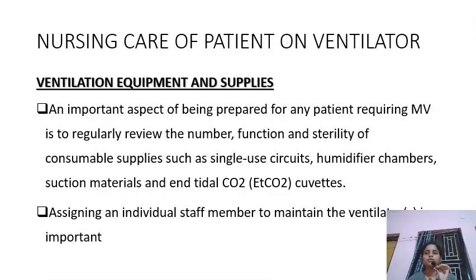So before each shift, there should be an assignment that the intubation trolley should be checked by the staff, like we check the crash trolley and the narcotics in our ICUs or in the emergency room. In the same way, the intubation trolley should be assigned to one staff who would check everything, I mean, the sterility and the functioning of the items.